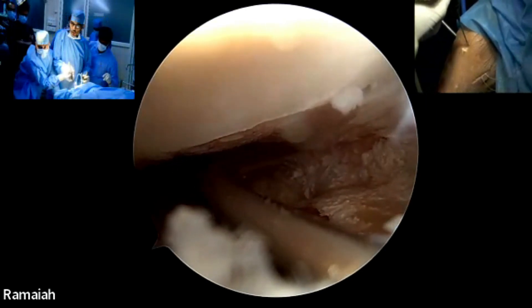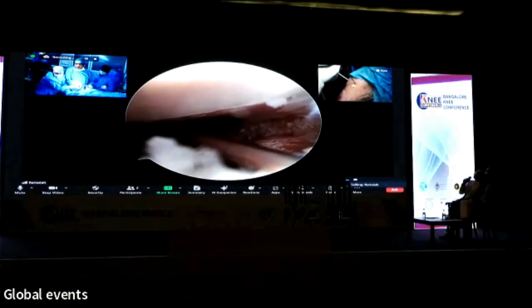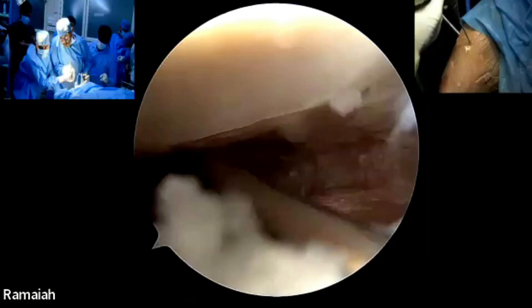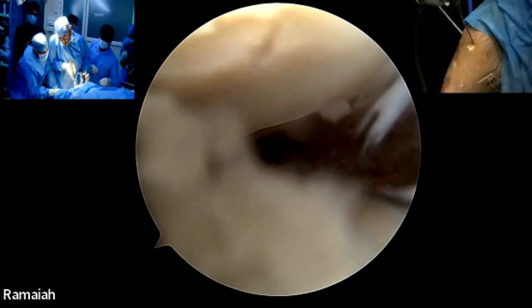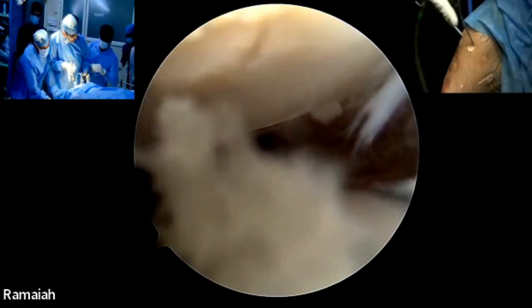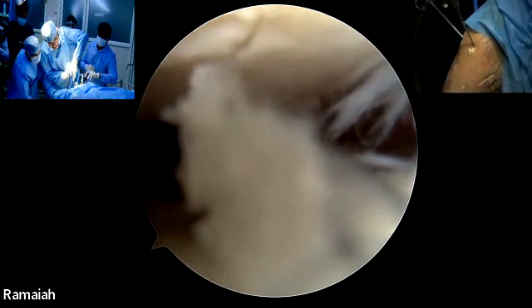Can you see the needle is coming out? Keep passing. Now the needle has come out through the skin here.